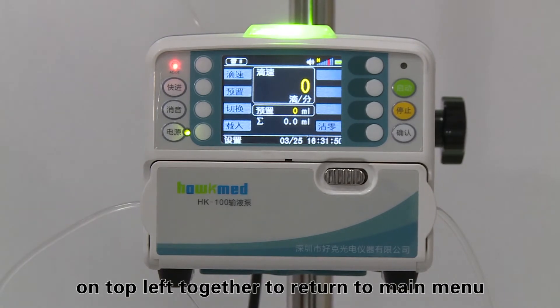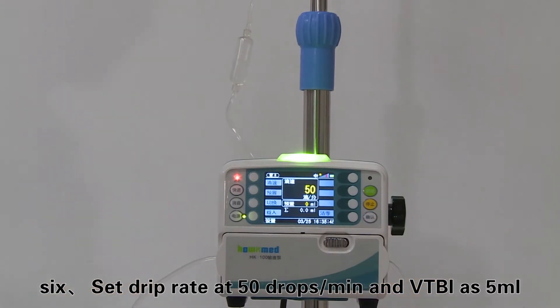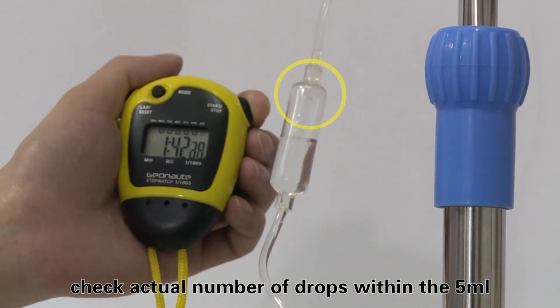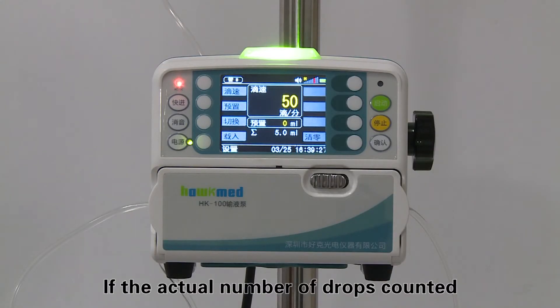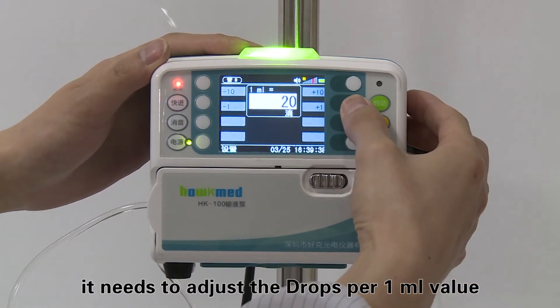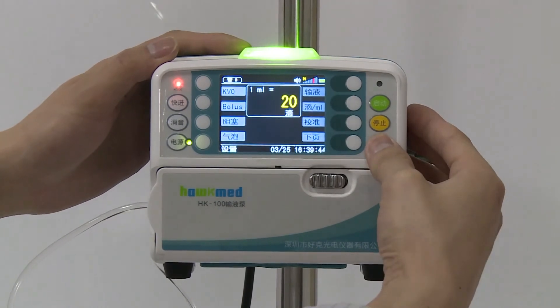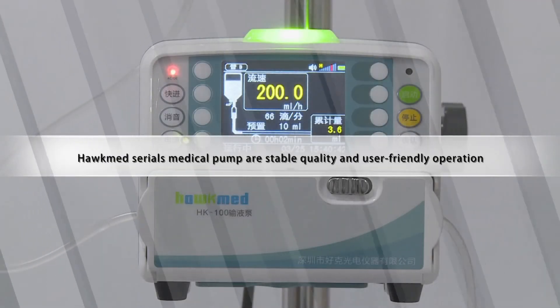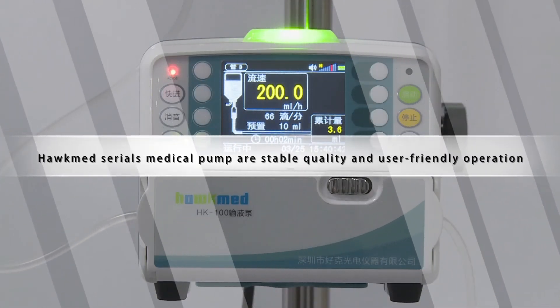Step six: set the drip rate at 50 drops per minute with VTBI at 5 mL and start infusion. Check the actual number of drops within the 5 mL infusion. If the actual drop count differs too much from the preset value, adjust the drops per milliliter value accordingly. Hawk Medical infusion pumps offer stable quality and user-friendly operation. Thank you for your cooperation.